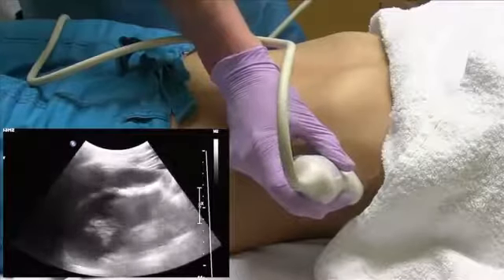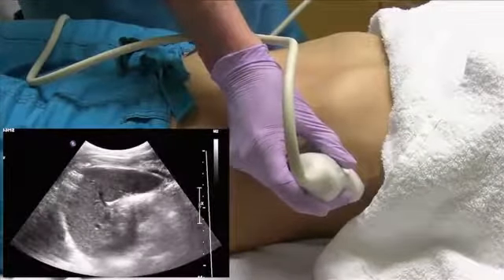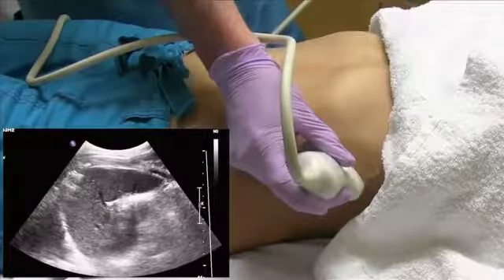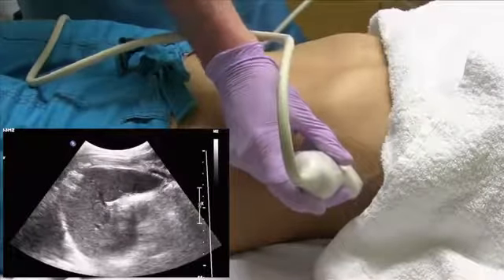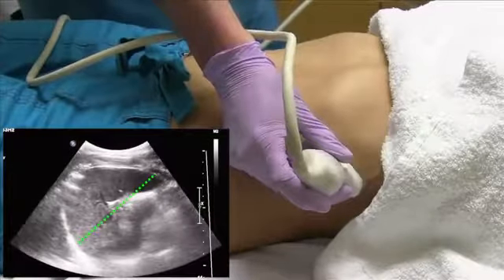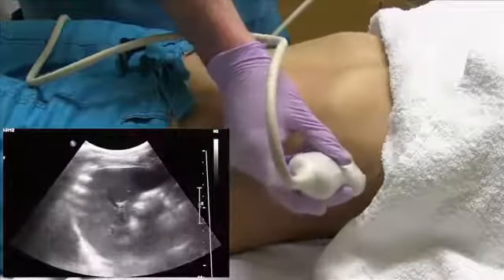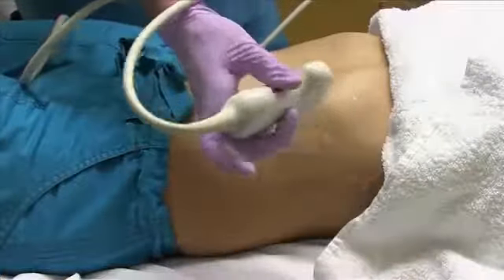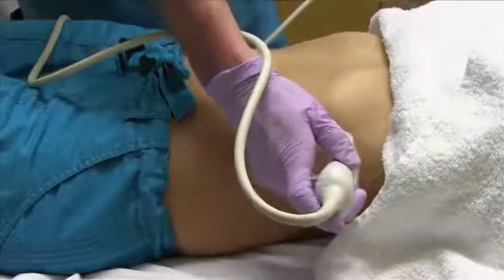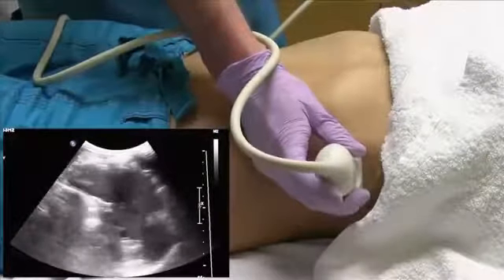For the spleen, once you get to the maximal dimension of the spleen, we usually measure the length of the spleen in this window here. And you sweep through the spleen completely in sagittal. For your transverse images of the spleen, you may see some of those rib shadows in your view.